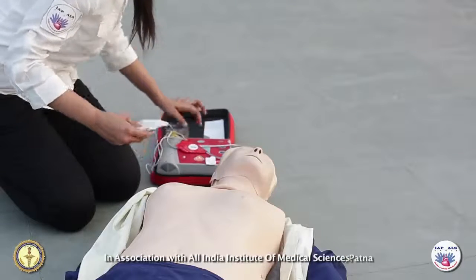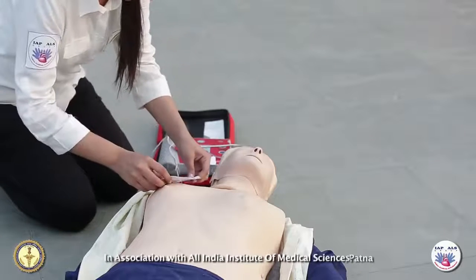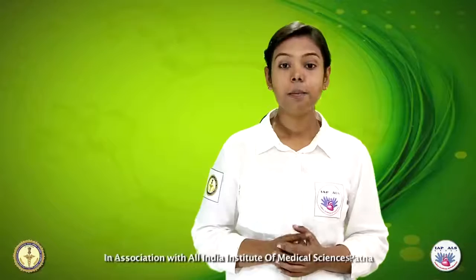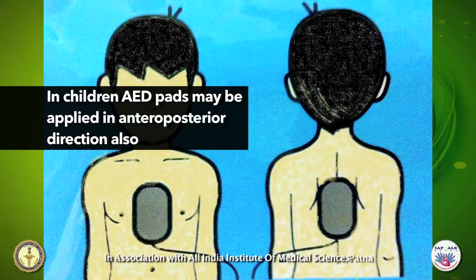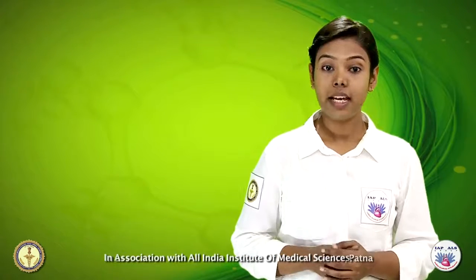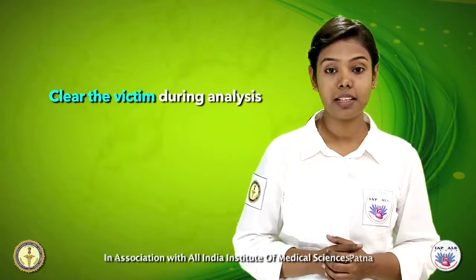Peel the packing away from the AED pads. Attach the adhesive AED pads to the victim's bare chest. Attach one pad on the victim's right chest below the collarbone. Place the other pad on the side of the left nipple. In children, AED pads may be applied in antero-posterior direction also. Attach an AED connecting cable to the AED box. Some are pre-connected. When the AED prompts you, clear the victim during analysis.